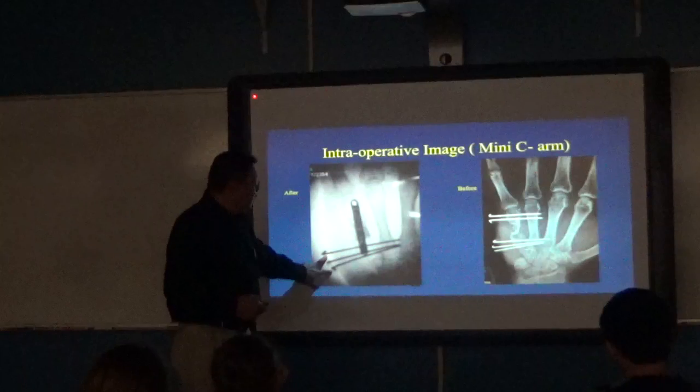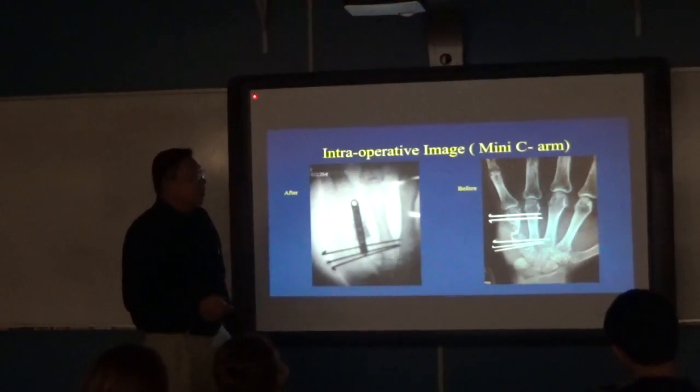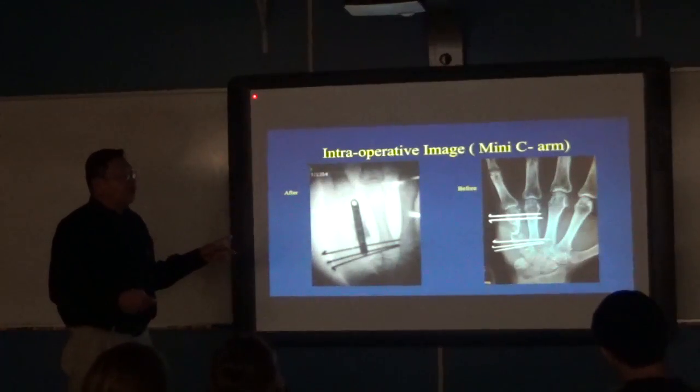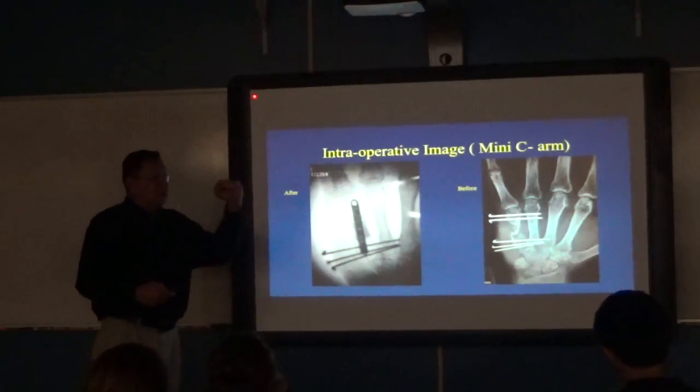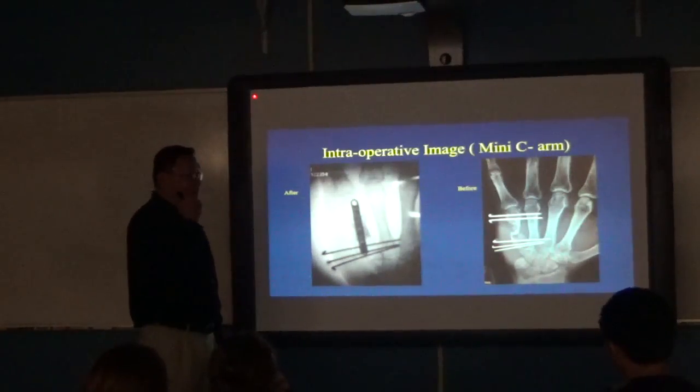And let the pins stay there for a little bit, then later on pull the pins out. This picture was about 3 or 4 years ago. He has full function in his fingers. He's out there teaching gun safety. And I told him I don't want to see him back in the clinic if he blows up his hand.